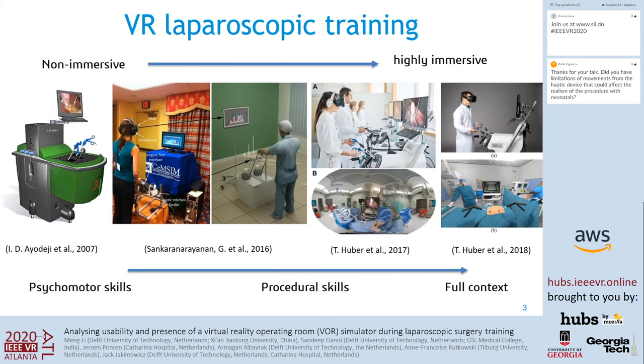Thanks to the introduction of virtual surgical simulators, surgeons are able to improve laparoscopic skills without subjecting patients to unnecessary risk or pain. We can see there is a trend of this kind of VR training from psychomotor skills to procedure skills and to training within the full context of the OR. Another trend, shown on top of this image, is from non-immersive applications to highly immersive applications.